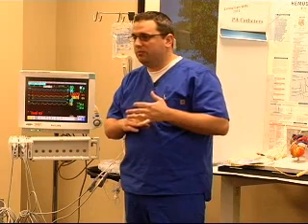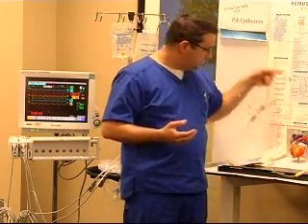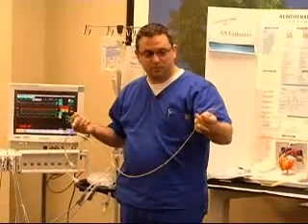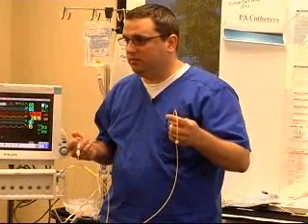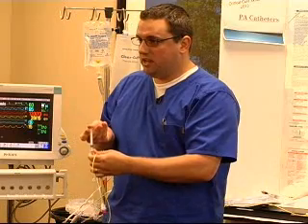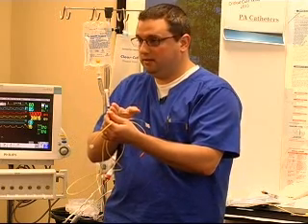Once you know that you're in the right atrium, they're probably going to ask you to inflate the balloon. Now, clear communication is really important whenever you're doing something like that. Let's say they say they're in the right atrium, balloon up, you put the balloon up, and you're standing here holding it. That's great. What happens if you let go? The balloon goes down. Then they're driving a harpoon through the heart instead of a nice little bubble tip catheter. So I tend to want to communicate to the practitioner, say balloon up and locked. When you say locked, there's a little lock device on here, and whenever the little red lines are not in line, that means it's locked.